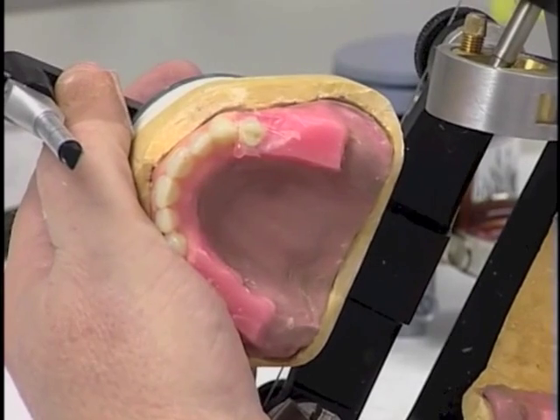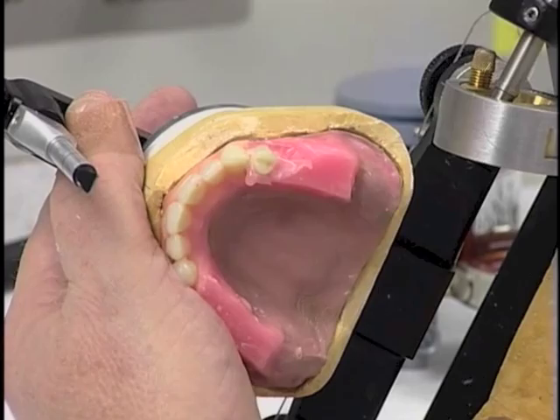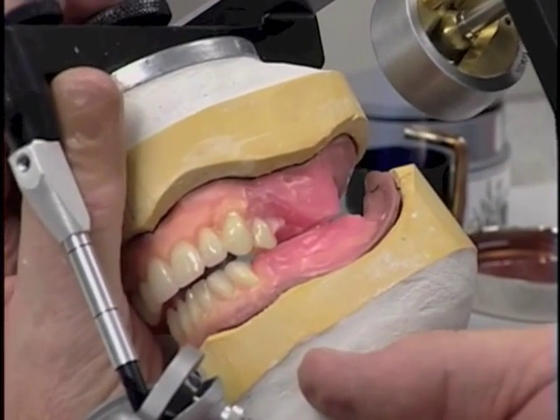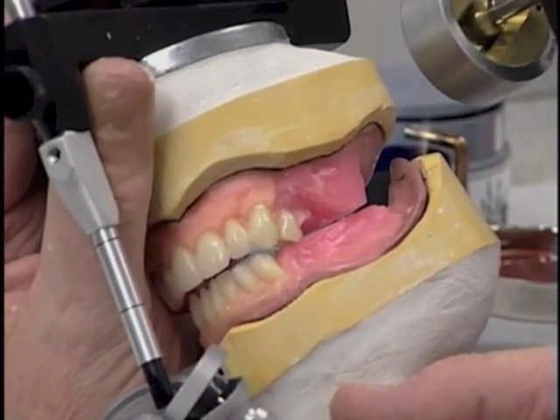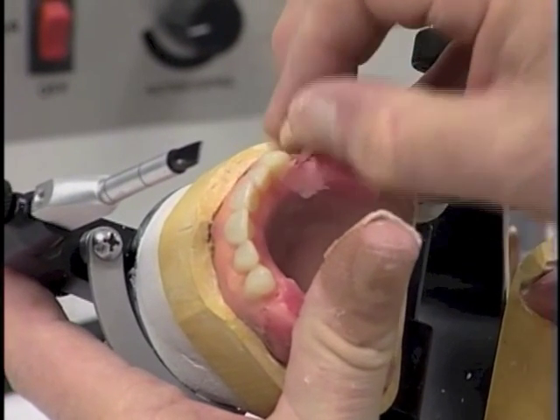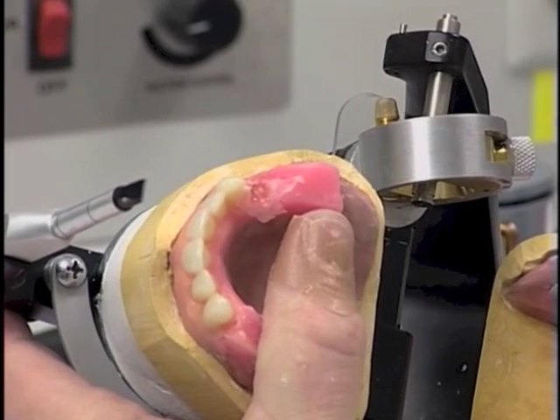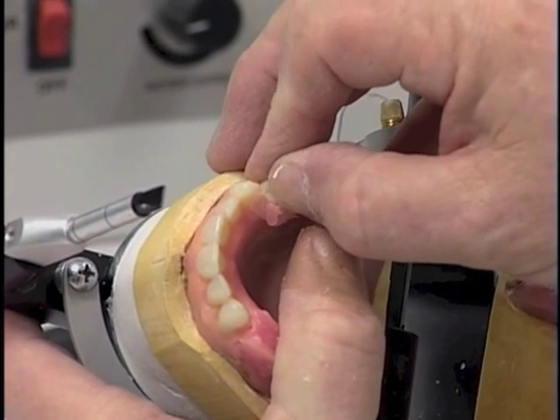that the arch form, when we look at it coming around, the arch form of this buccal cusp continues the arch form that we started with the anterior teeth. We want to arrange it at an occlusal height that's compatible with the canine, and as you can see at this point, that will not close all the way, so we need to raise the tooth slightly from where it is at this point. So we're going to remove the tooth, pull the wax some more. And now let's see if we can get the premolar to go into place in the position where we would like it.